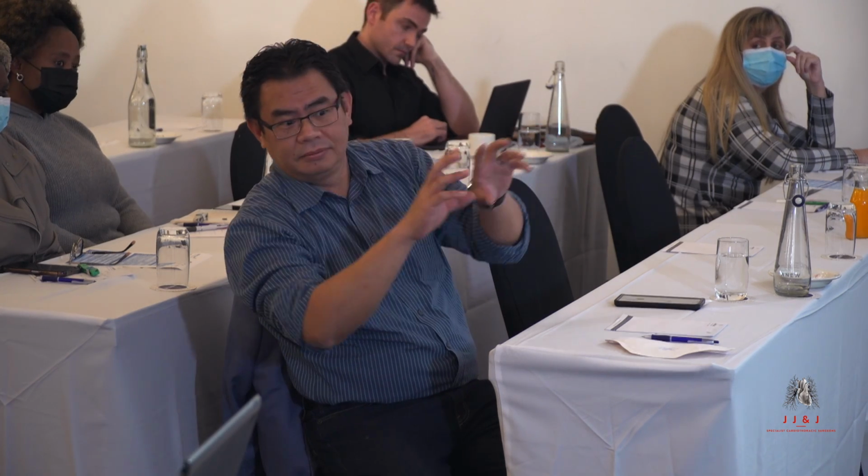Cardiac surgery patients, regarding cardiac monitoring, there are various systems. One of them is that we see the monitoring line actually being strapped to the patient's arm. To me, I don't know what people feel, but where I came from in terms of training at Albulatuli, at the back of the patient's bed you actually have a bridge to hold those monitors. So which one do you think is better?